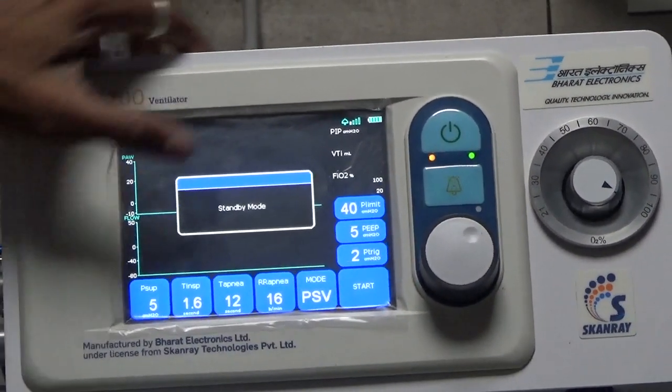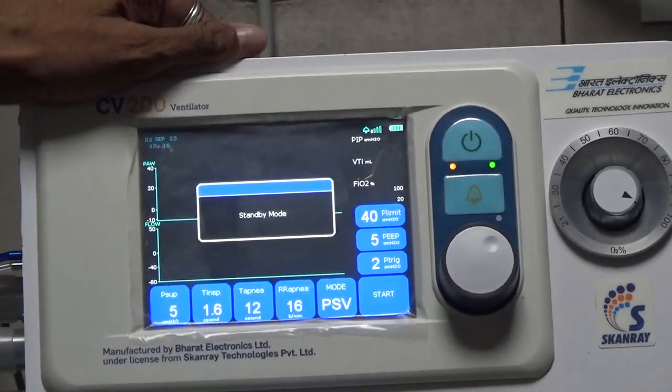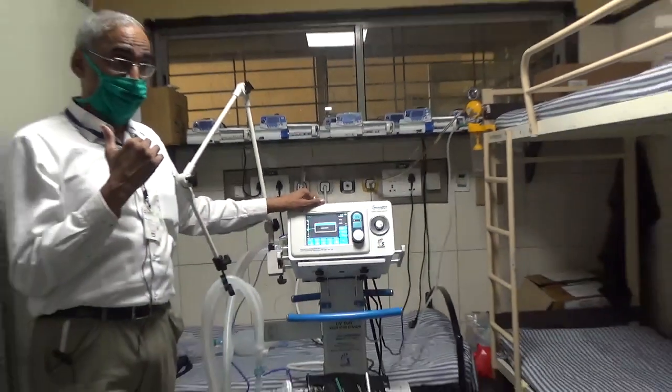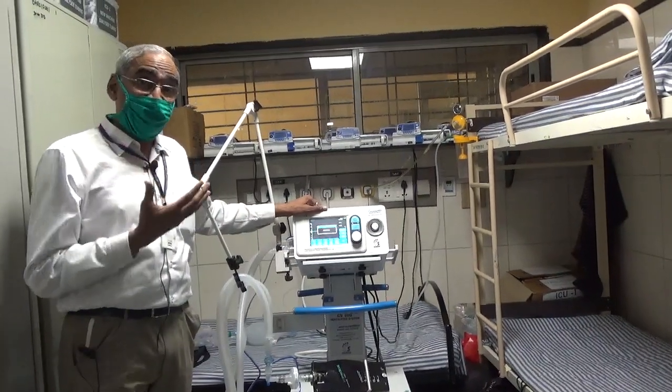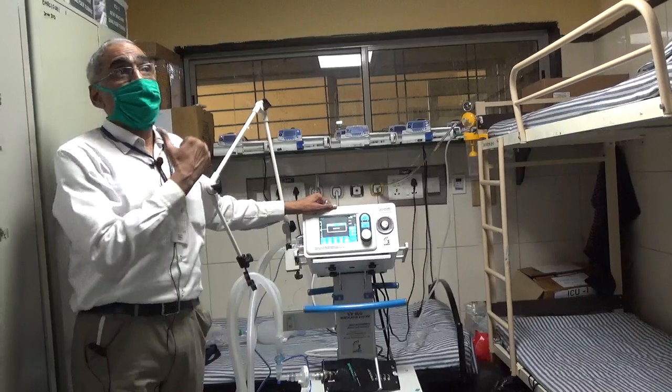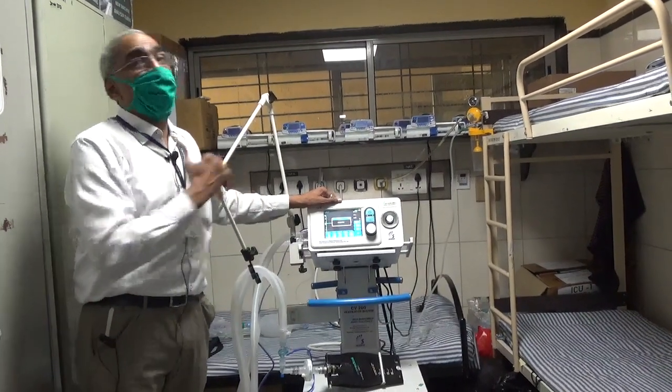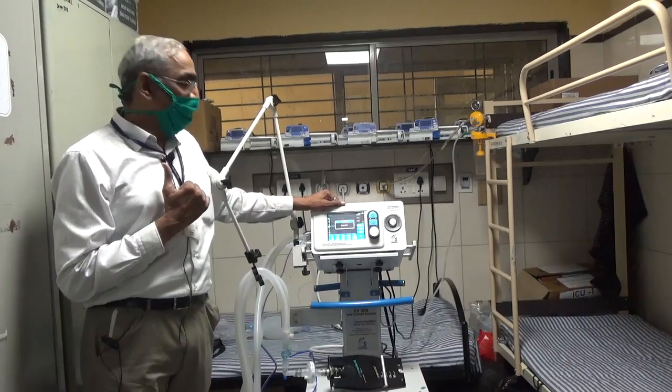So pressure support 5, PEEP 5, total inspiratory pressure is 10. Okay, so here, when we talk about the settings on non-invasive ventilation, we'll say that total inspiratory pressure is 10 and PEEP is 5 and the pressure support level is 5. I hope you have understood this.